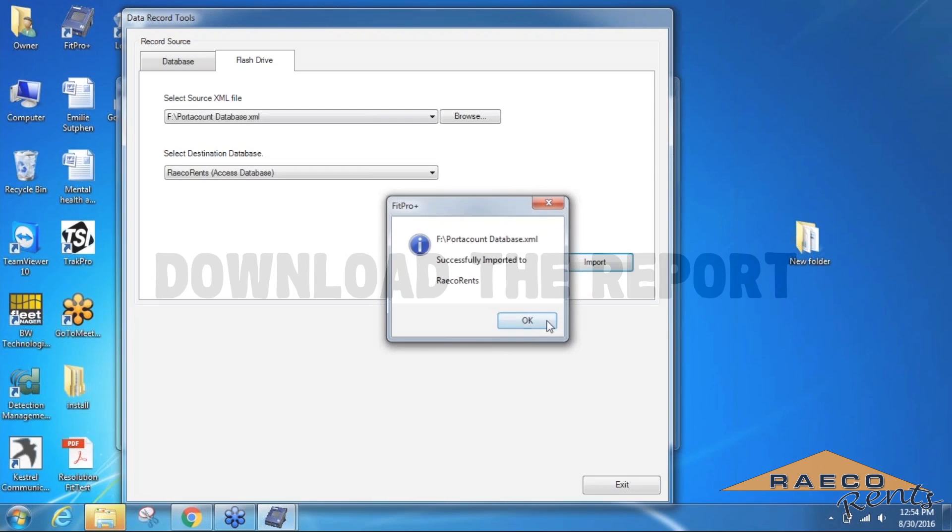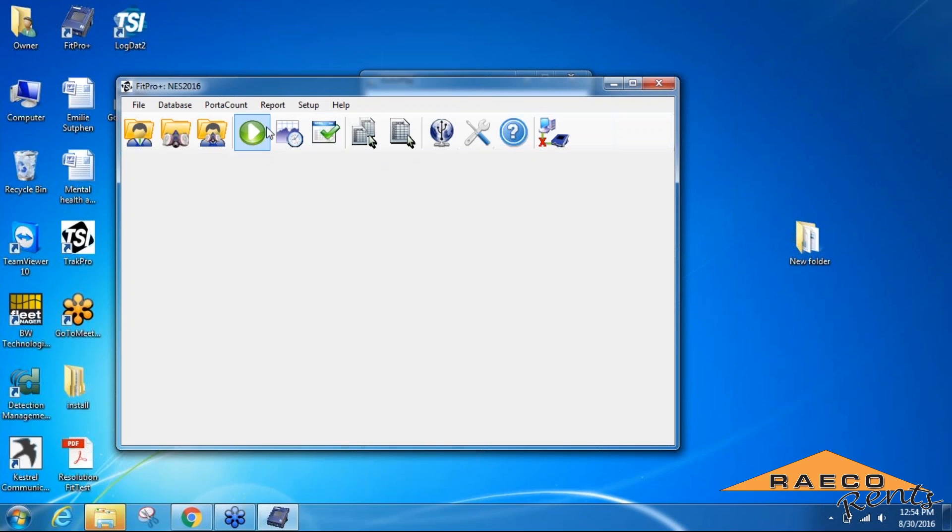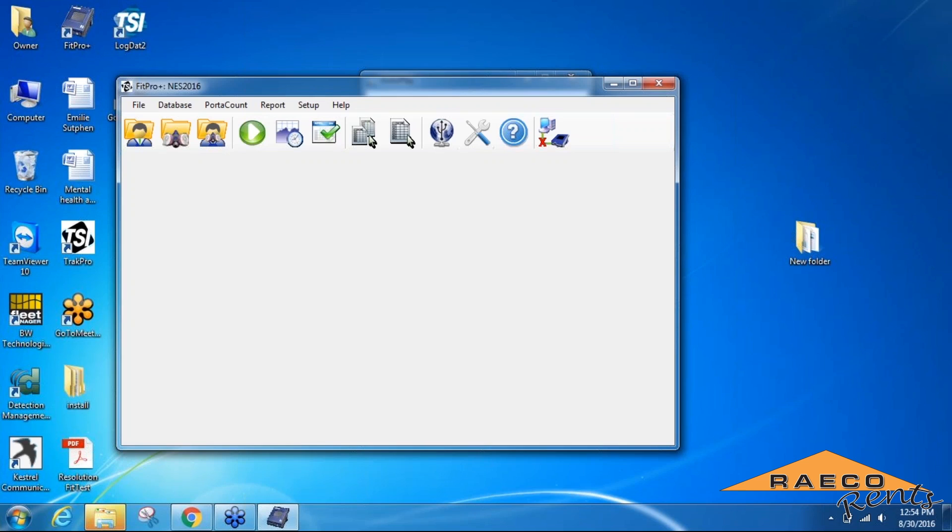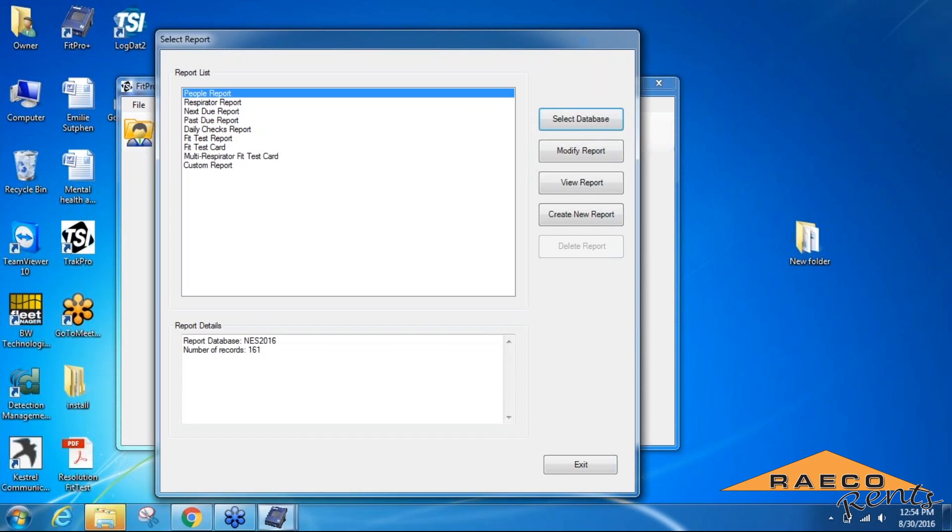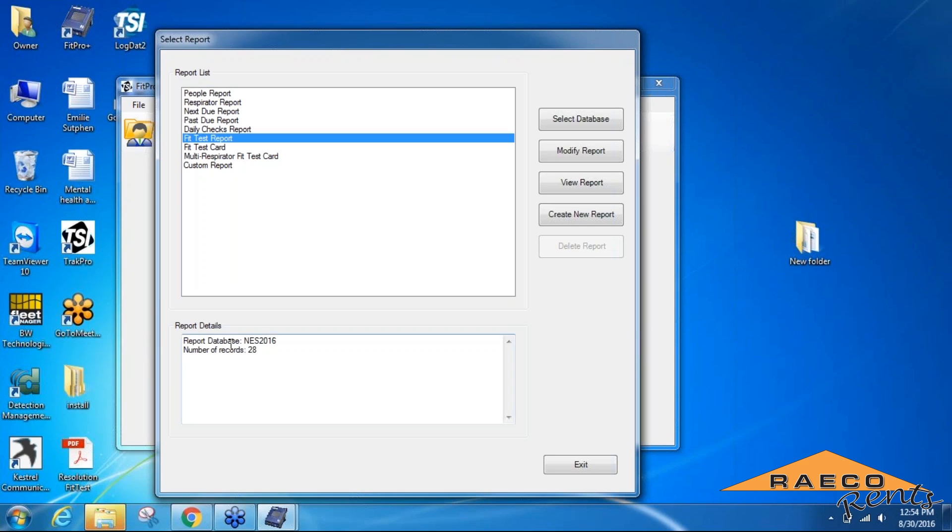Once it's done importing everything, we can then generate a report. We'll back out to the main screen on FitPro and go to the Report tab now. We'll select a report, and we're going to generate a fit test report in this case. When you select that option in the list, if you check at the report details at the bottom, you can verify that all of your records are there, and then view the report.